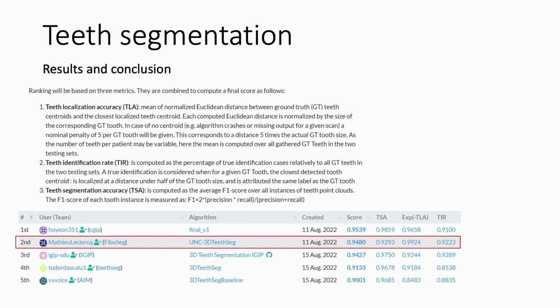For example, we kept this architecture for the SLCN challenge, where the task is the prediction of gestational age at birth, and the input is a scan of the surface of a brain of a neonate. And we achieved very convincing results and ranked second on this challenge as well.